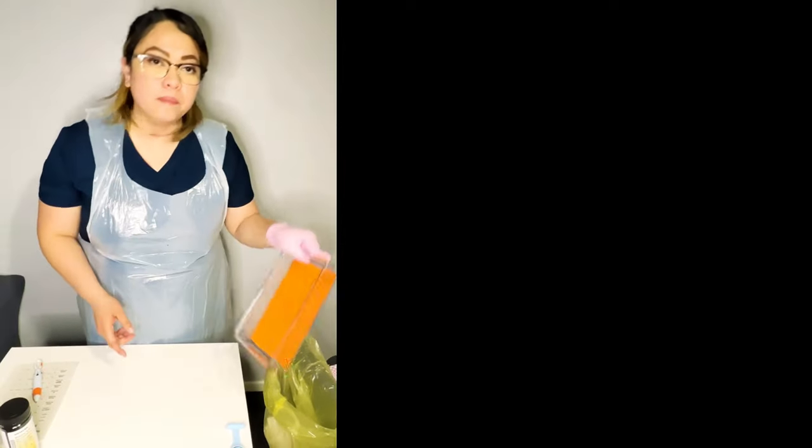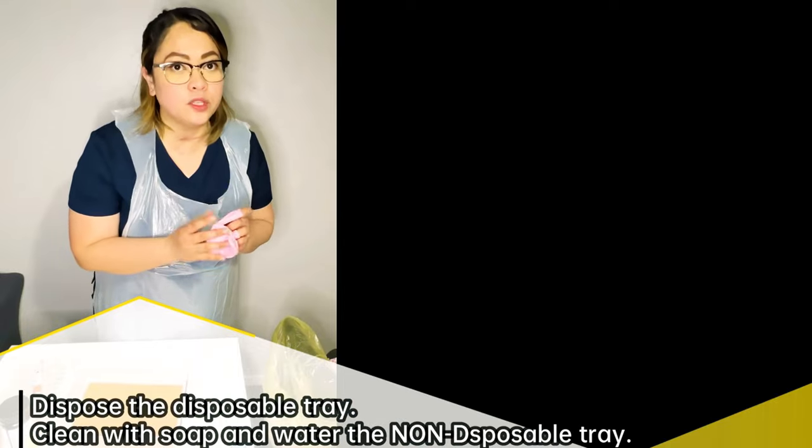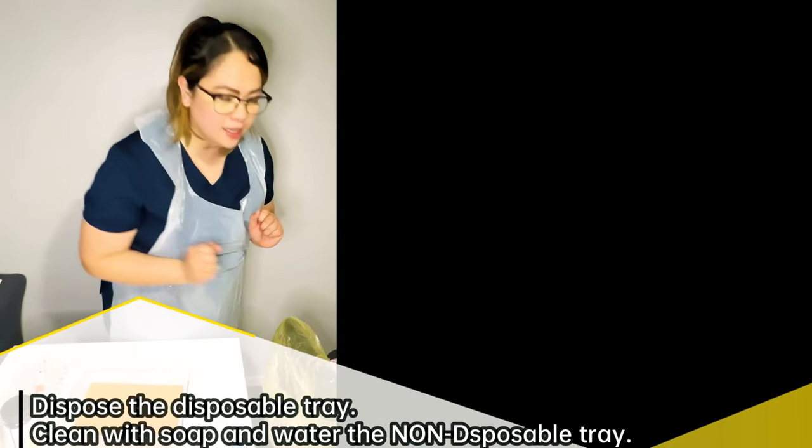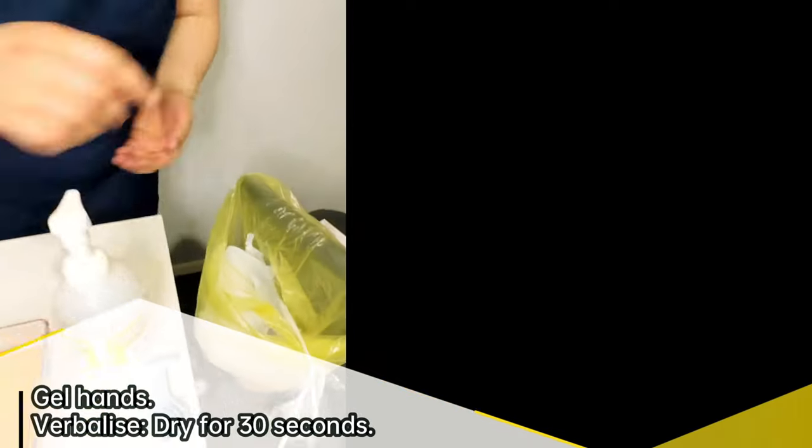If you are using a disposable tray, then dispose it. But if you're not using a disposable tray, then just clean it with soap and water. Okay, I'm gonna dispose it. Apron. Then I'll gel my hands. Okay.